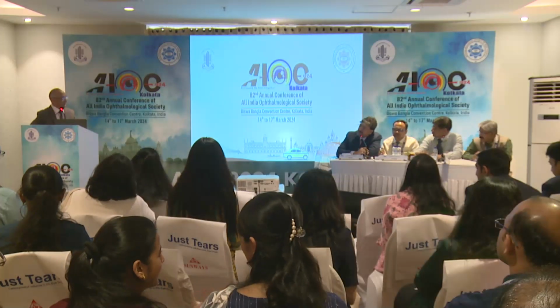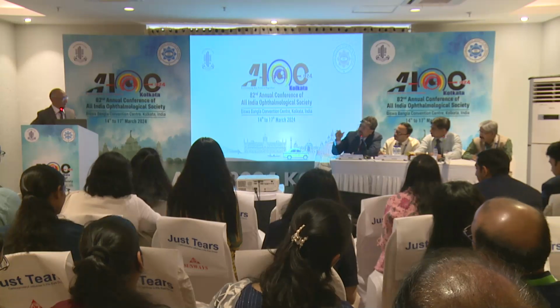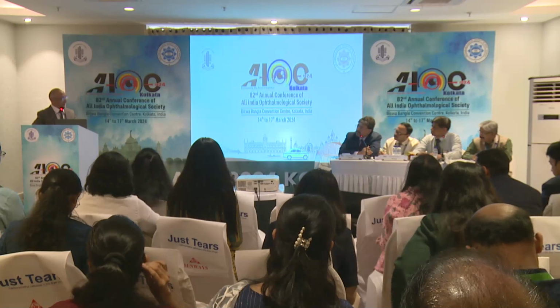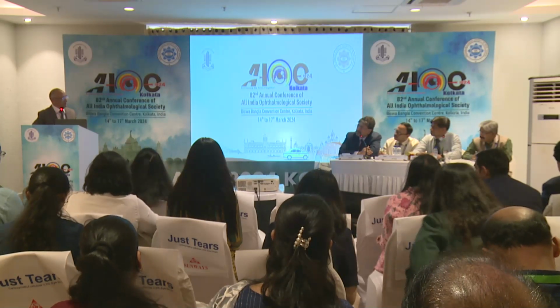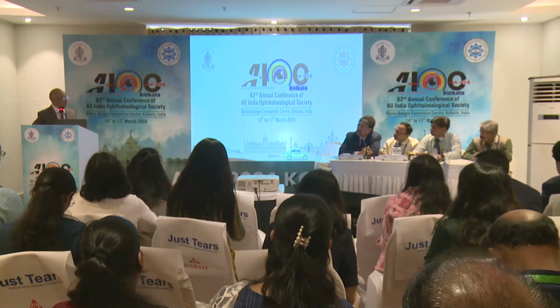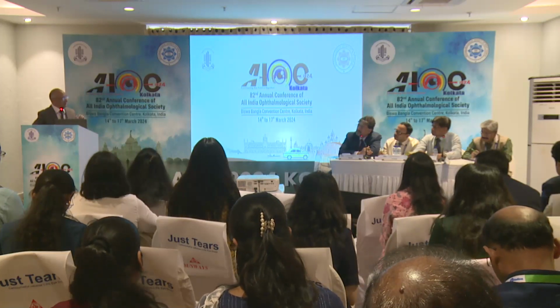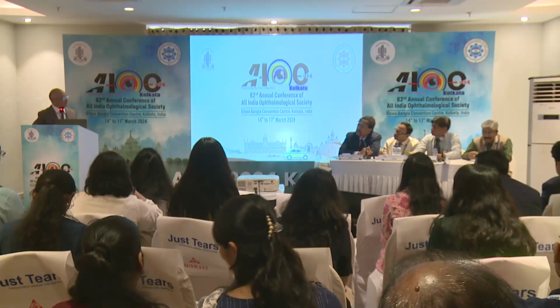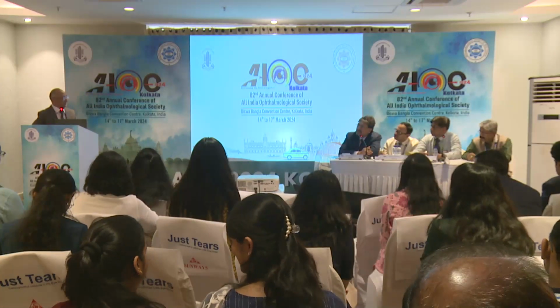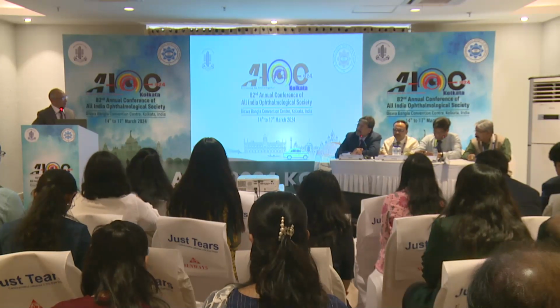And have you ever tried, sir, deliberately doing a posterior capture for a toric lens so it doesn't rotate? No, that situation normally doesn't arise most of the time, but it will be those cases where your rotation is too large, like a bag that is too big, or post-myopic eyes, post-vitrectomy eyes. There you might try, if your one attempt doesn't give you a rotation, and post-op you feel large rotation happening, then you might try. But that situation comes very, very rarely. That will really fix the IOL in its place. Very rarely, and it's a technique to be used.